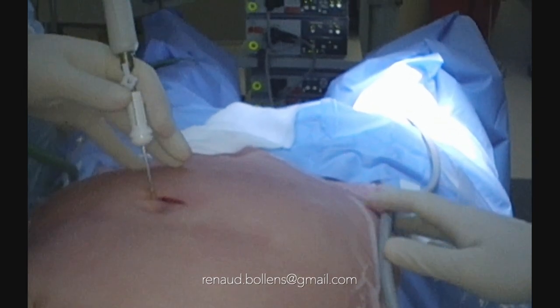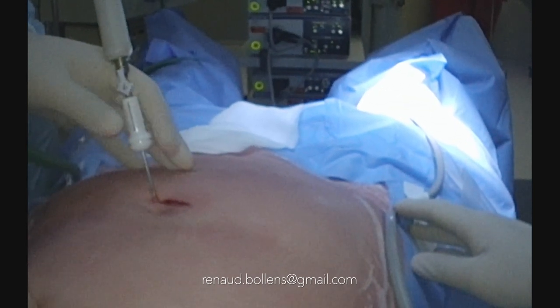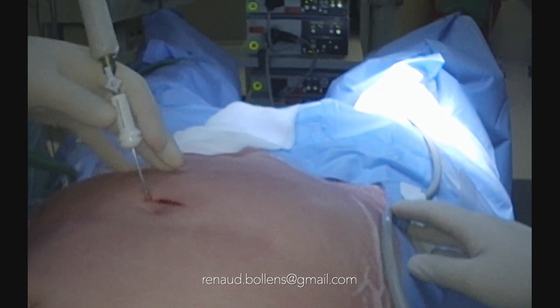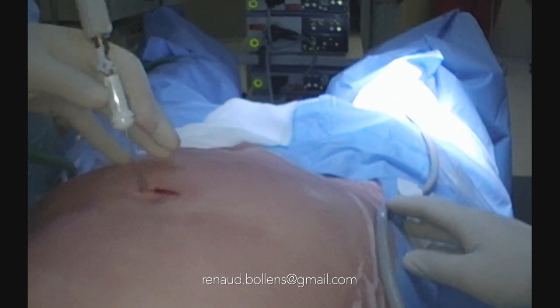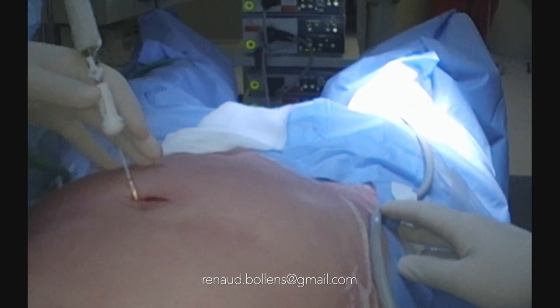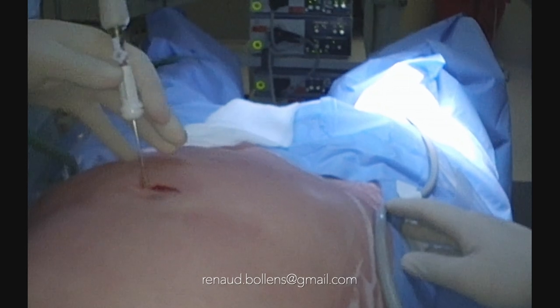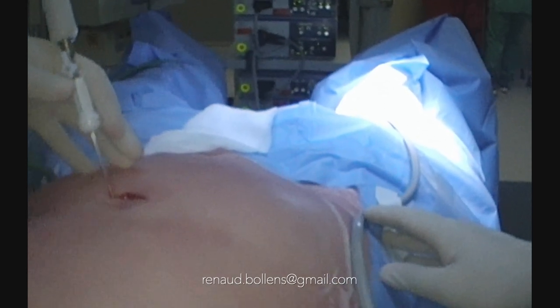Also, because if the needle is inside the omentum, it can be blocked. If I have a hyperpressure, it's the tip that is inside the omentum. What I do, I move back and I shake in the axis of the needle. I don't turn to make jam of fruit because I can have bleeding from the omentum. Then I just move back in the axis of the needle and I shake it.